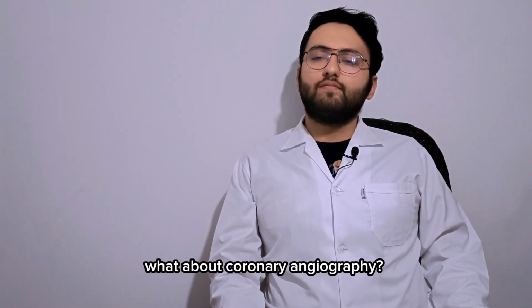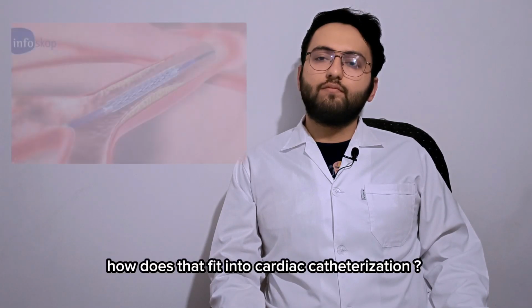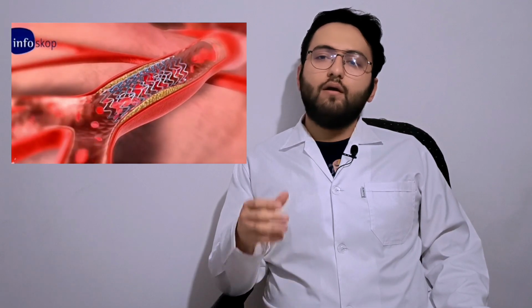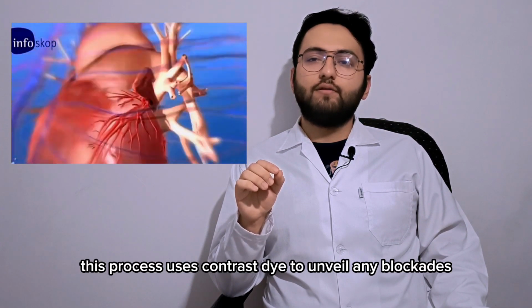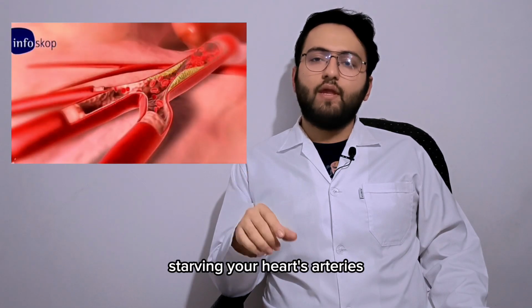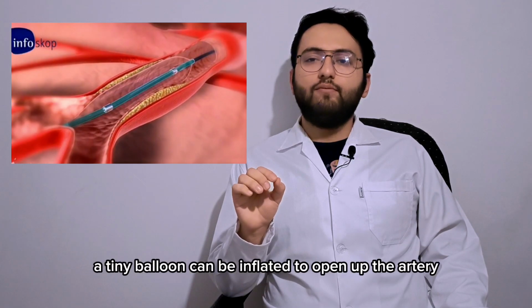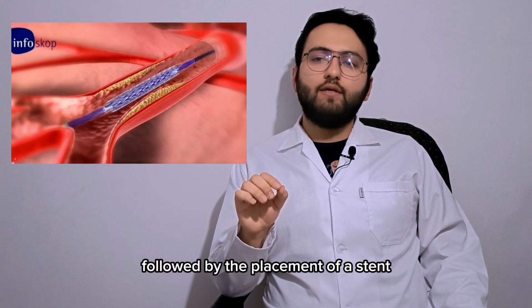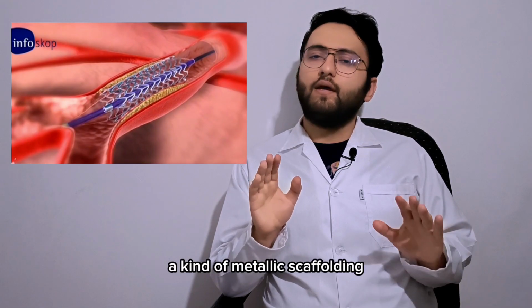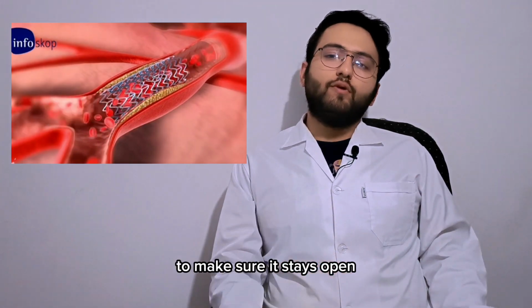What about coronary angiography? How does that fit into cardiac catheterization? This process uses contrast dye to unveil any blockage starving your heart's arteries. And if there happens to be a significant blockade, a tiny balloon can be inflated to open up the artery, followed by the placement of a stent, a kind of metallic scaffolding, to make sure it stays open.